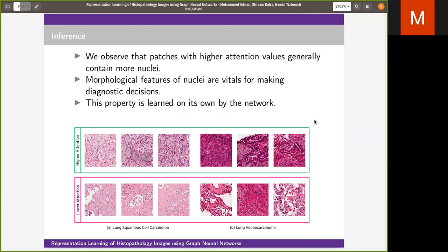In the figure, the top row depicts the higher attention patches, which are important patches, and the lower row consists of lower attention patches or less important patches. The interesting property that we noticed is that higher attention patches have high nuclear density. This property is learned by the network on its own without any supervision.